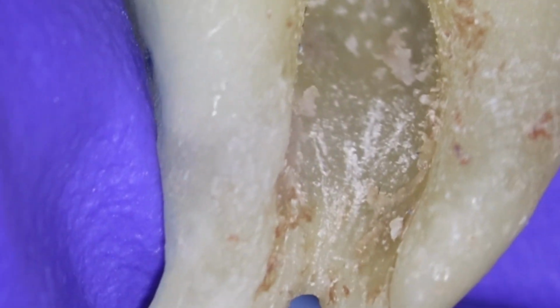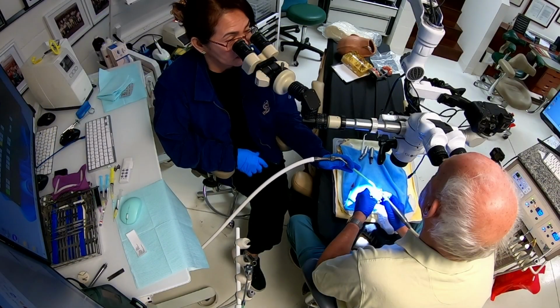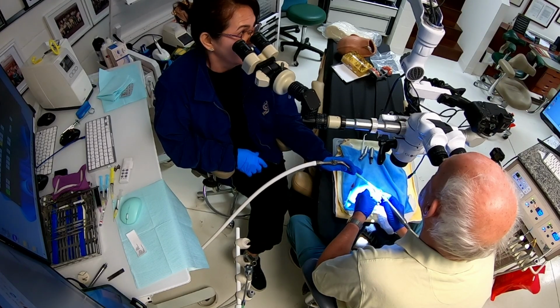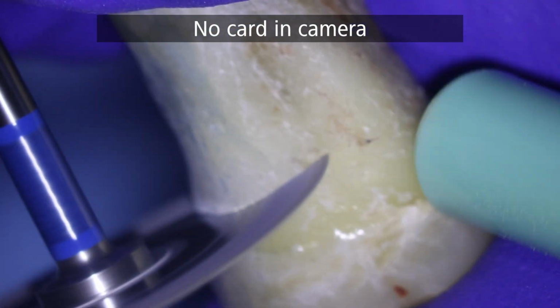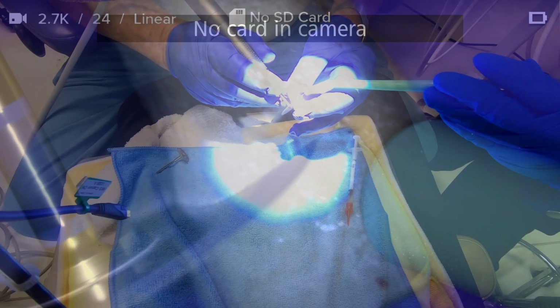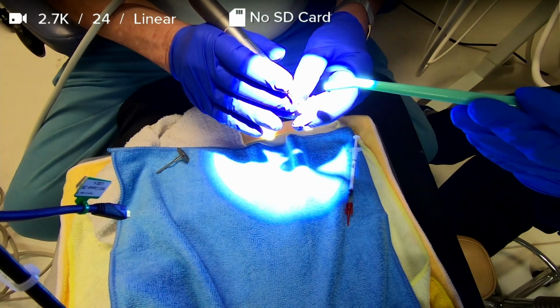So the first thing to do is to section it axially, and it is actually in the operatory doing this. Dr. Carwan made it to get some practice with Resolve. So that's why we're doing it this way. We can show it in multiple views. This is one using the GoPro camera, and then we have the microscope camera, and we have the various cameras around the op that we can switch to, which we do in Resolve.